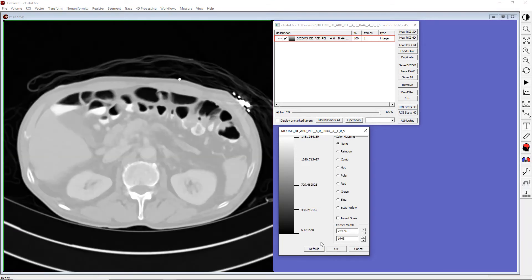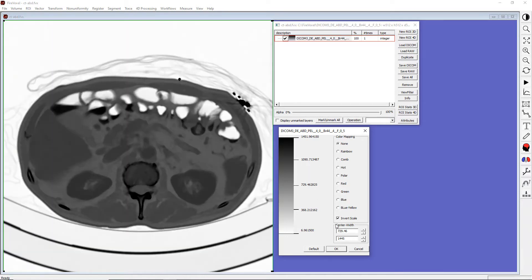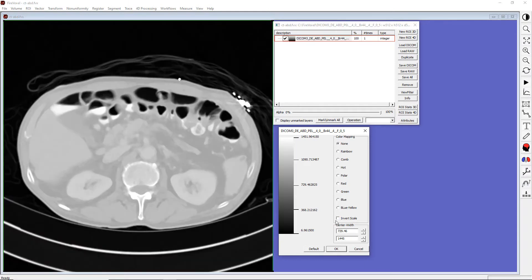Right now, higher signal intensity values are shown as lighter gray levels. If you want to show higher values as darker shades, click Invert Scale. And when you are done, click OK.